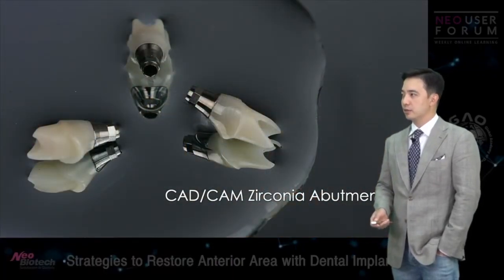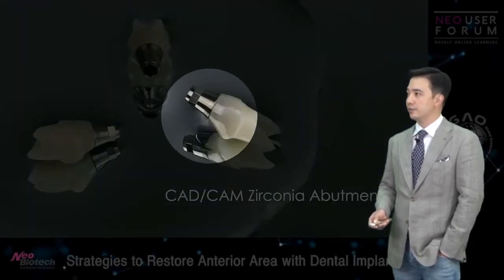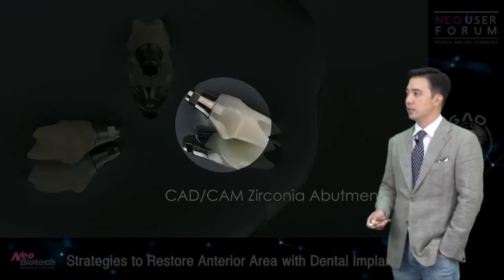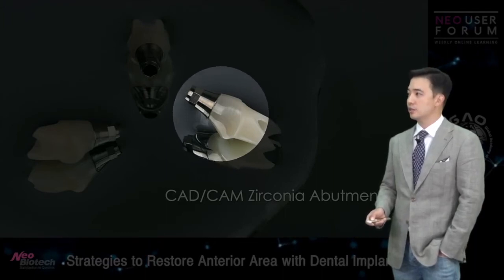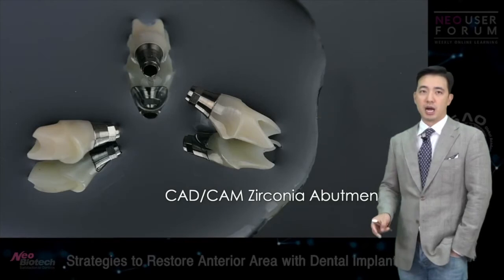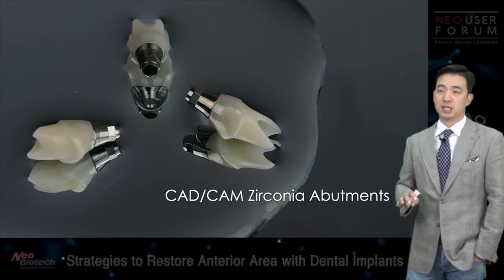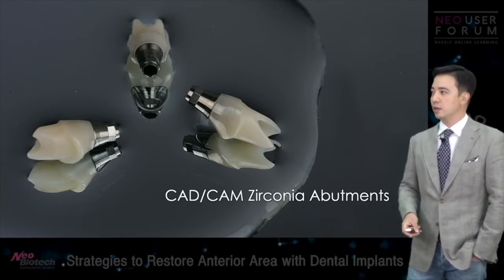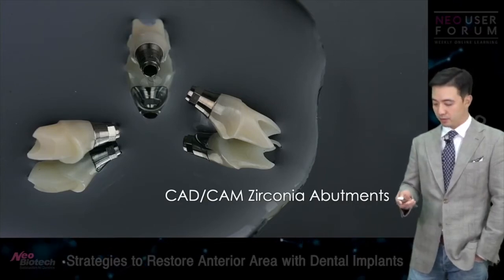Well, the good thing about zirconia abutment, as you can see on the photo here, is that, look at the surface here, okay? Compare those two surfaces between titanium and zirconia and see how shiny and really, really smooth the zirconia surface is. As you all know, a highly polished zirconia surface is the most dense and most smooth surface of all the materials in the field of dentistry. And I think your patient's soft tissue likes that smooth surface, okay?